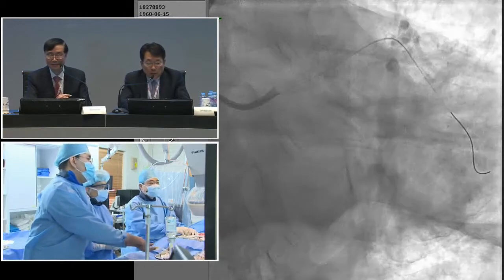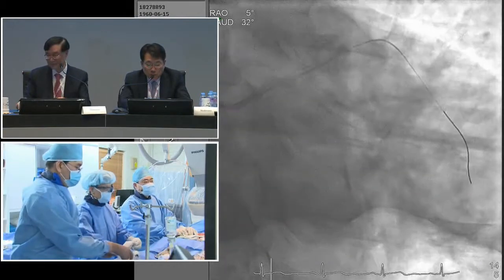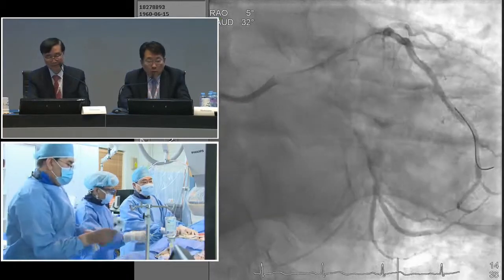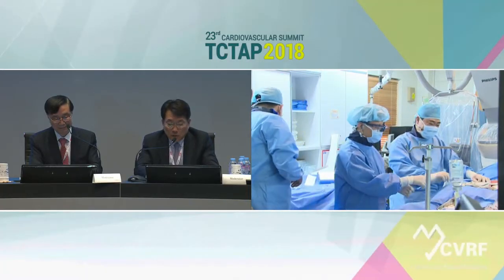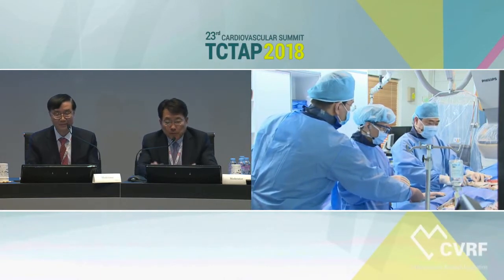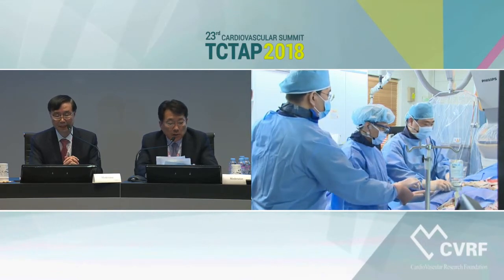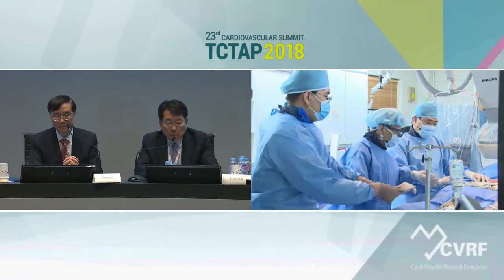Okay, very good. I think it's a great angiographic result. Dr. Kim, thank you for joining us, and congratulations, it's an excellent lab case. We want to move to Dr. An's case briefly.